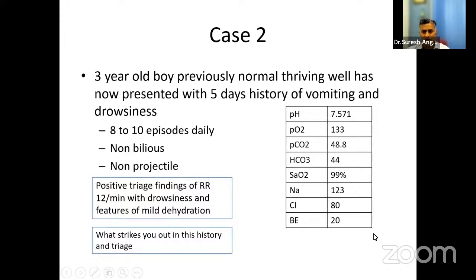So this is the blood gas of this child. So again, as pinpointed by Rohit, the metabolic alkalosis is there. And what about CO2? Can someone interpret this blood gas based on those 6-7 steps? Yes, sir. They are answering, sir. Yeah. So what is their answer? Is it compensation, overcompensation by respiration, or what? Mixed disorder by Dr. Alok.